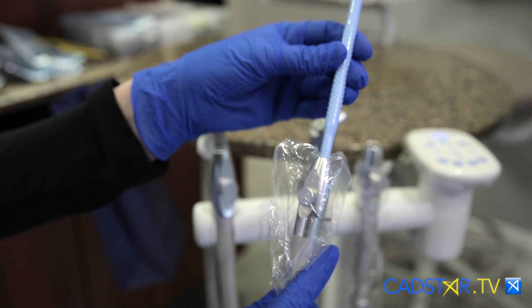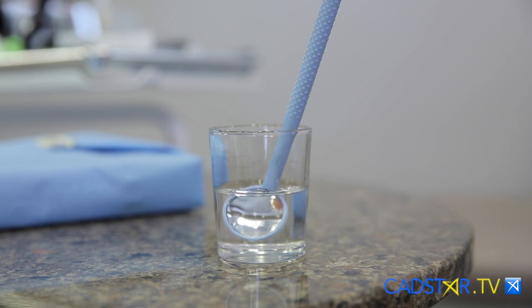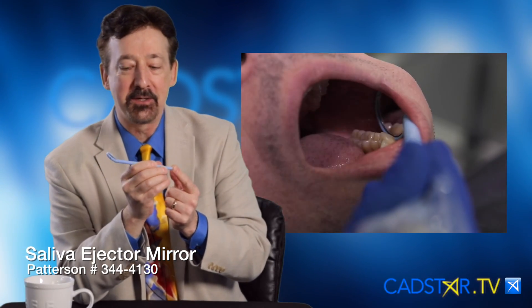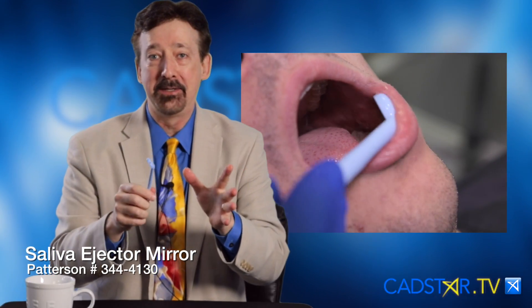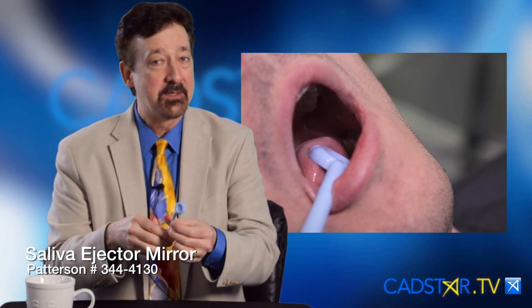The other thing that works really well is this mirror that hooks onto the suction. This mirror is a saliva ejector mirror. You attach it to your slow suction, and it's going to keep the saliva away from the teeth. It's the best way to go.